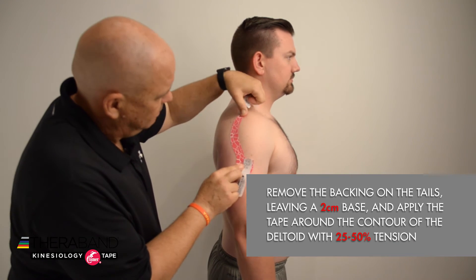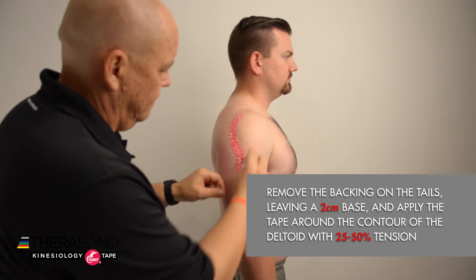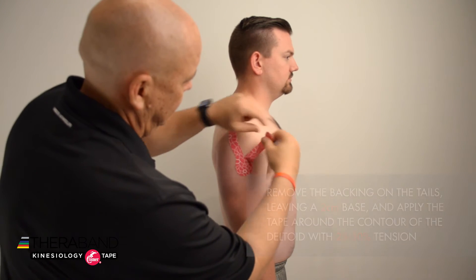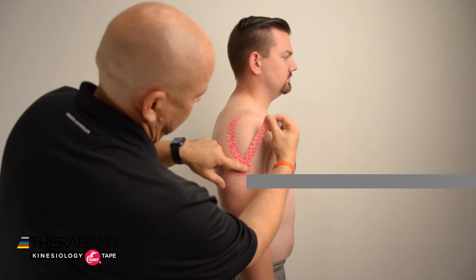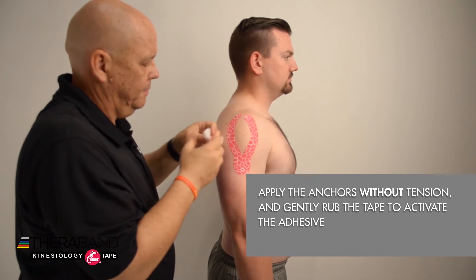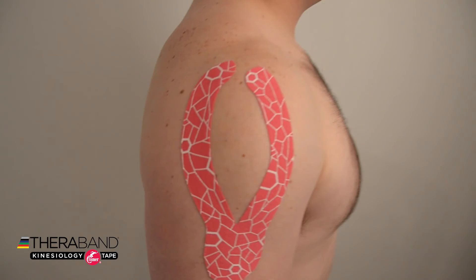Then I'm going to apply 25 to 50 percent tension around the contour of the deltoid, and then apply the anchor by removing the remaining backing of the tape and applying that without any tension. Then we're going to rub the tape to activate the adhesive.